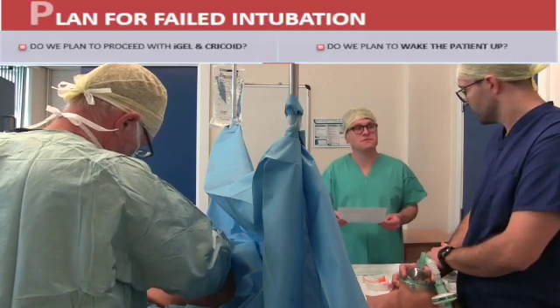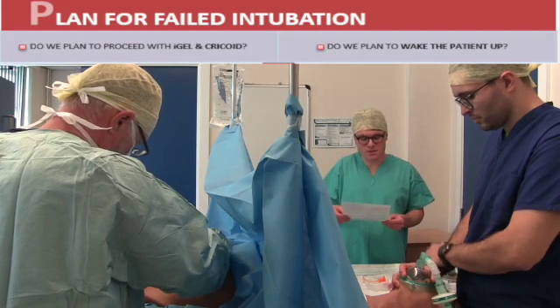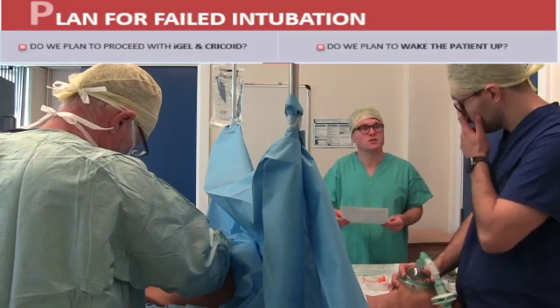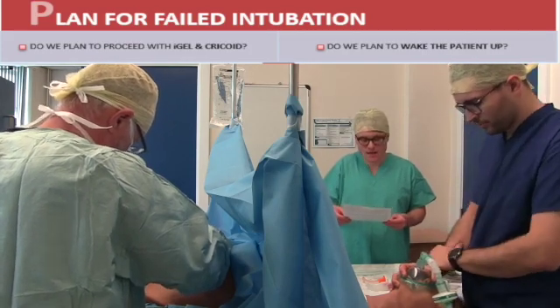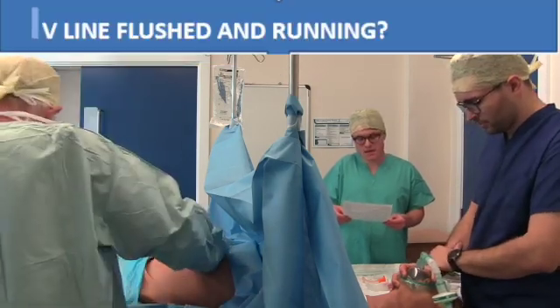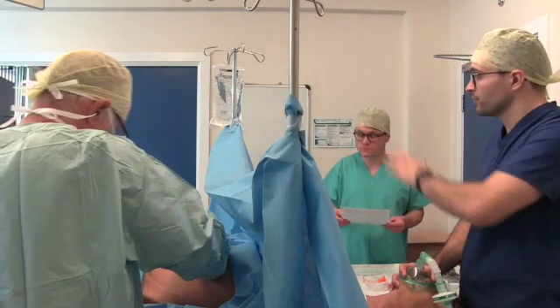Next section — plan for failed intubation. Do we plan to proceed with I-gel and cricoid? Yes. And is the IV line flushed and running? Yeah, that's running.